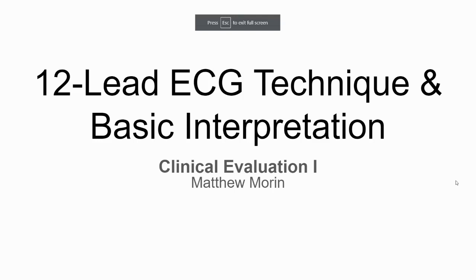So welcome to this presentation on 12-lead ECG technique and the basic interpretation of 12-lead ECGs. As first responders, paramedics play a crucial role in identifying and treating patients experiencing cardiac events such as myocardial infarctions or other acute coronary syndromes.